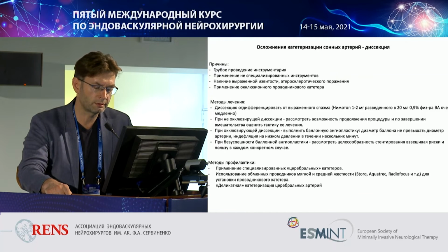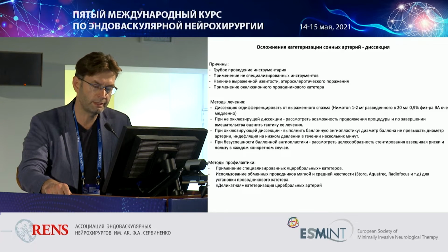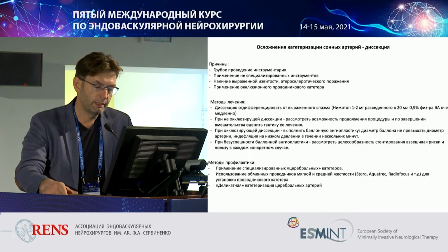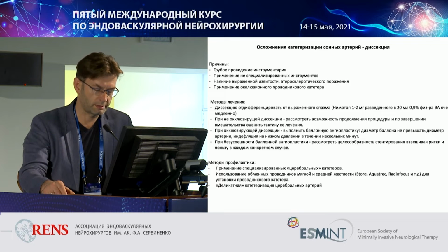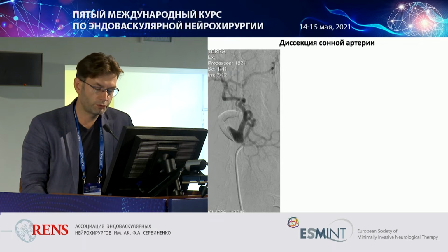If it's a non-occluding lesion, you can put the guide wire catheter in to perform thrombectomy from the intracranial basin, and then go back to the extracranial section and decide if the dissection is preserved. You may perform prolonged balloon angioplasty, but if it doesn't help, you may perform implantation of a stent.